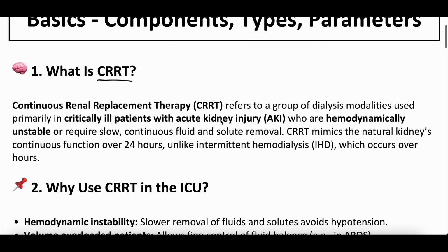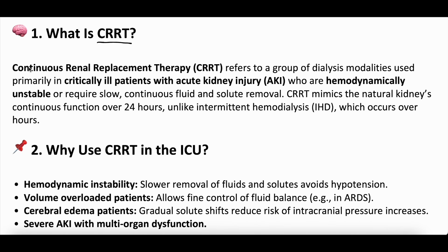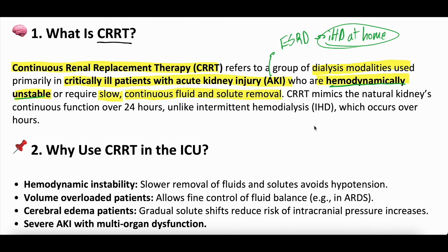CRRT. What is CRRT? Well, CRRT stands for Continuous Renal Replacement Therapy, and this is a group of dialysis modalities used primarily in critically ill patients with AKI who are hemodynamically unstable. Now, you can have patients who, instead of AKI or acute kidney injury, have end-stage renal disease, ESRD, and are on intermittent hemodialysis at home or in the outpatient setting, but now they're critically sick and hemodynamically unstable, and as such they require this slow, continuous fluid and solute removal, that they're not able to tolerate their intermittent hemodialysis anymore.